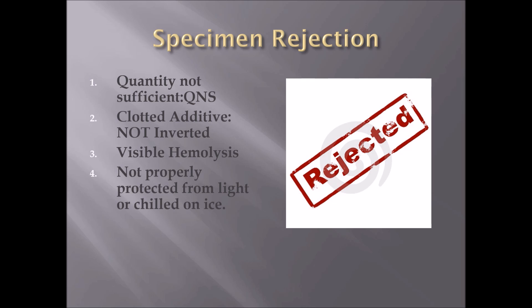Number four: not properly protected from light or chilled on ice. Certain specimens need to be protected from light or chilled on ice, and failing to do that right away could compromise the sample and cause it to be rejected. Number five: using the incorrect tube. If the test requires a lavender top tube and you use a green top tube, it will be rejected. Number six: unlabeled specimens. If you send a specimen without it being labeled properly, it will be rejected. Make sure all required information is on the tube — whether printed or manually written — meeting the requirements of your hospital and laboratory. Do not send a specimen that has not been labeled correctly.